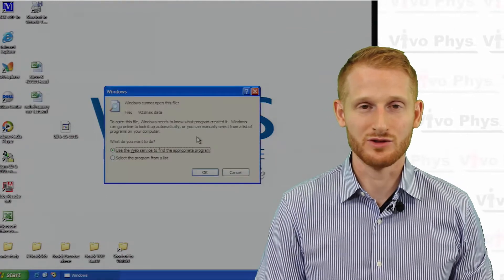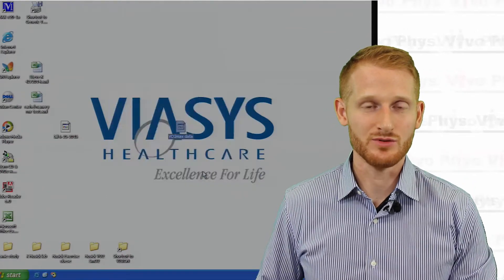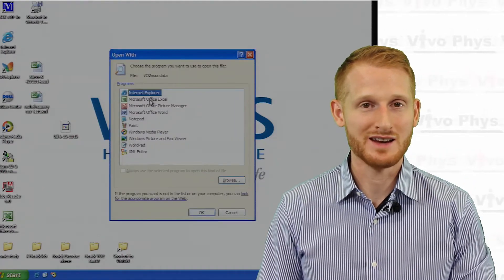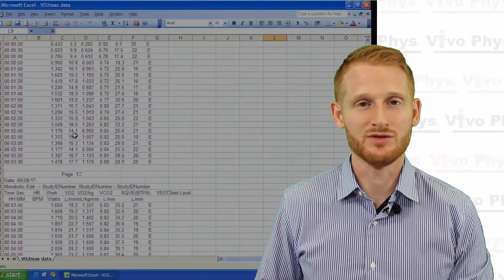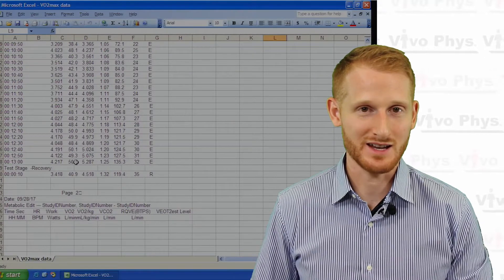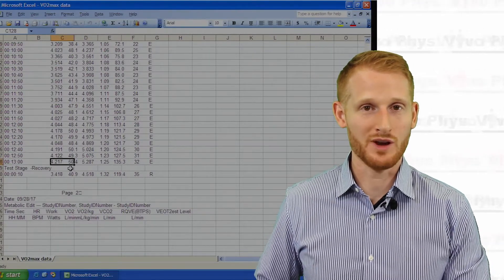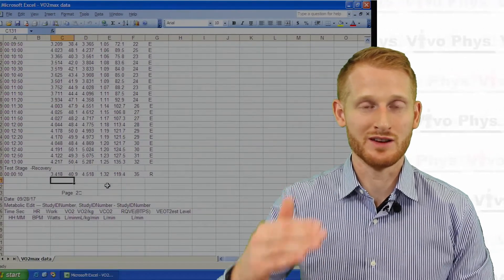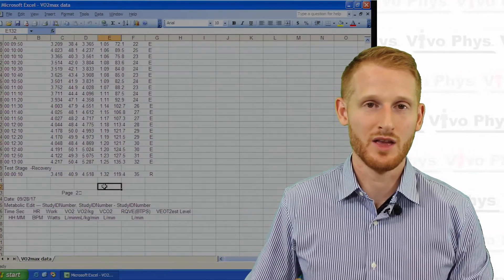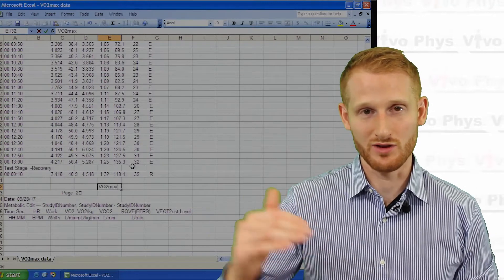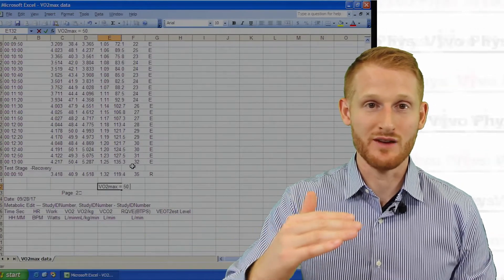Once you've done that, you essentially have a text file. It may not be recognized as a text file, but it will function as a text file if you try to open it in a text editor or in Excel. You can then look through the data and find the VO2 max of the person as well as find what their VO2 and several other parameters were every 10 seconds because we saved it as a 10-second average file.